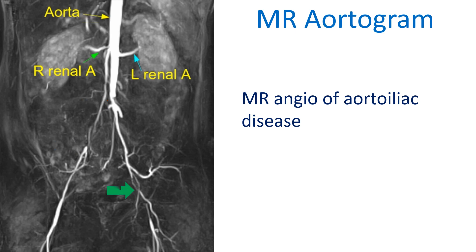The left common iliac also has a tight lesion progressing to a near-total occlusion towards the external iliac. The right renal artery has ostial disease, while the left renal artery appears to have a good-sized proximal region.